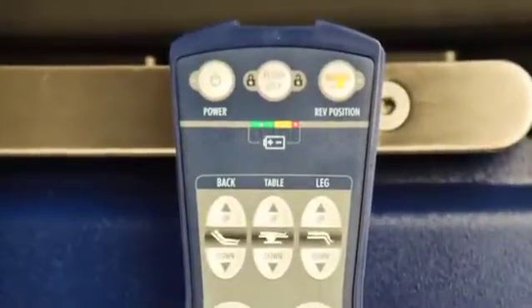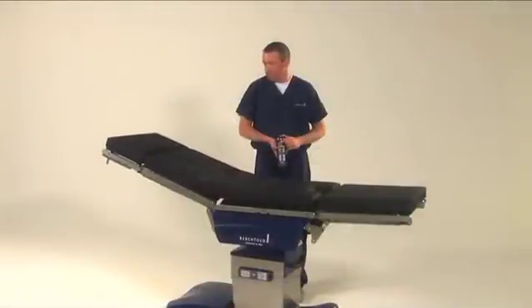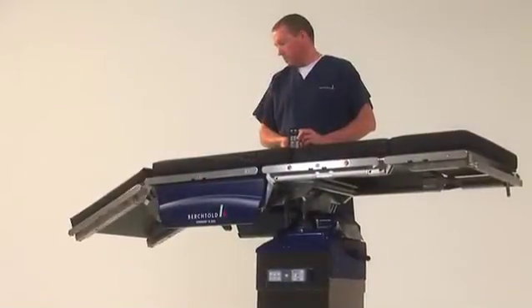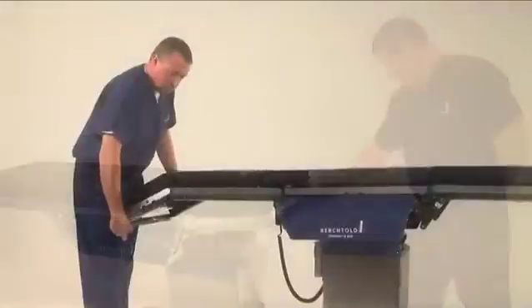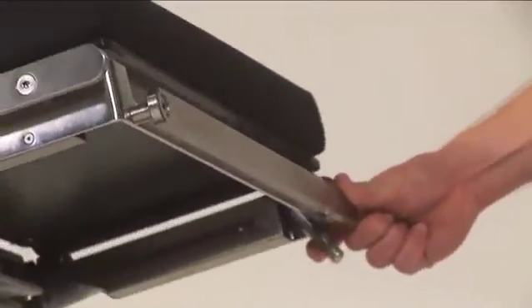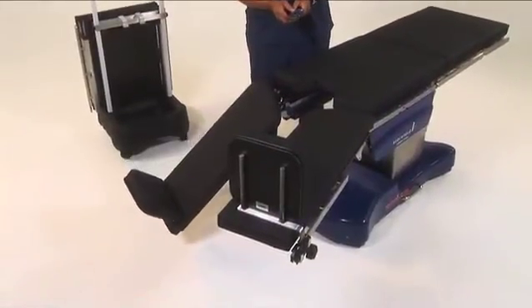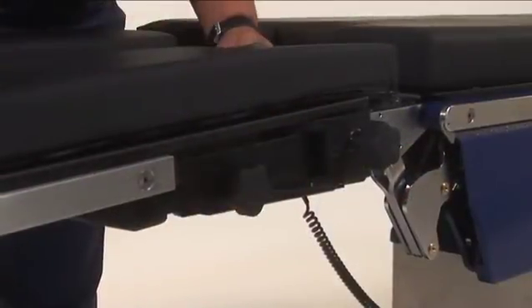The most commonly used articulations are indicated on the upper half of the hand control, including lifting the back section, raising and lowering the table, and lowering and lifting the leg section. The head section can manually be raised by 45 degrees or lowered by 90 degrees using the adjustment lever on the right-hand side. The Operon D820 features power split leg functionality to raise and lower the leg sections independently, but for patient safety, the abduction and adduction are handled manually.